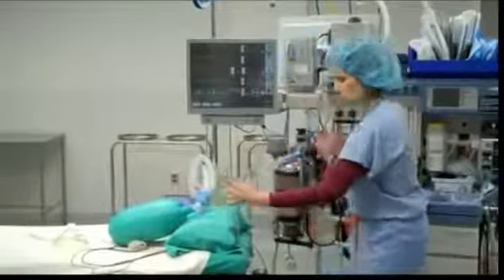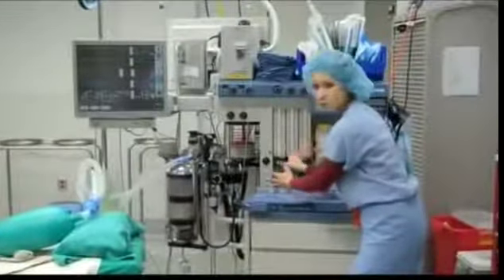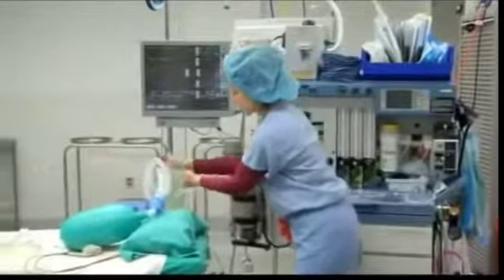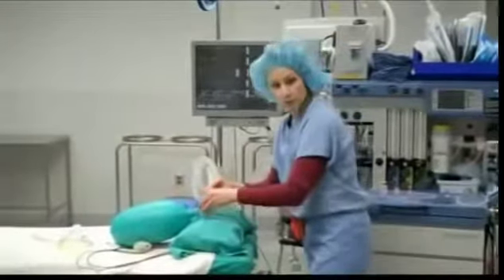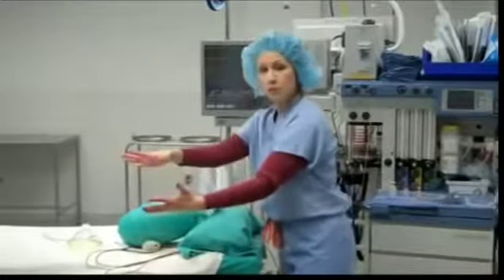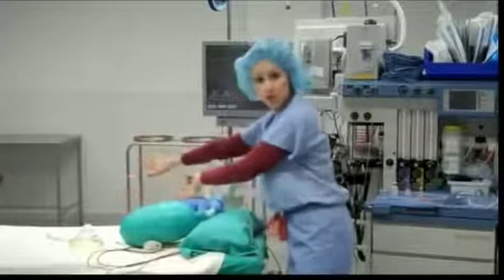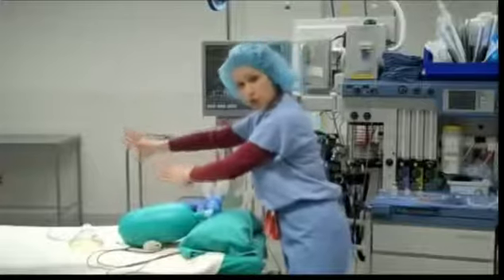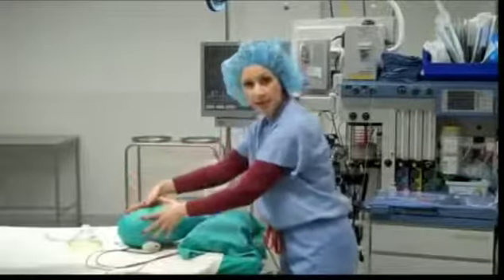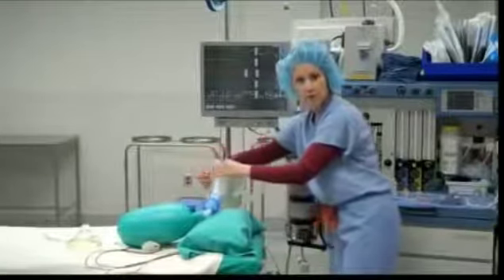And so to recap, what we have is anesthesia gas being sent through the anesthesia machine into this side of our circuit. The gas travels through the breathing tube, which is in the patient's mouth at this point, into the lung. Okay? The bloodstream then picks the anesthesia gas up from the lung and delivers it to the tissues. On return, the bloodstream then picks up the gas from the tissues, brings it back to the lungs. Okay? The gas is then extracted out. It comes out the other side of our breathing circuit, okay?